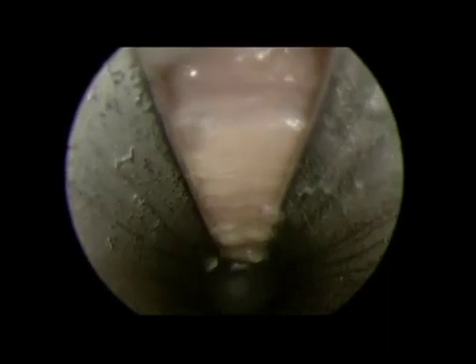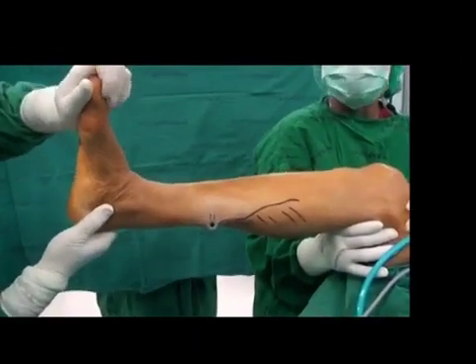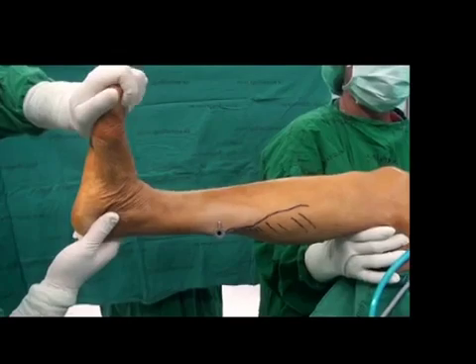You can observe the thickness of the fascia and the whitening atrophy of the gastrocnemius muscle due to the patient's long-standing equinus. After the gastrocnemius fascia is completely cut, the muscle can be observed by moving the ankle up and down. Ankle dorsiflexion is then measured and is approximately 10 degrees.